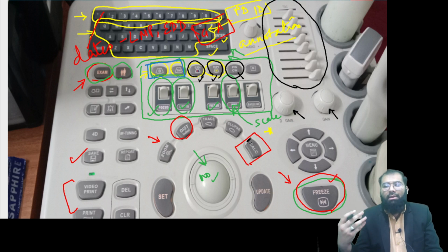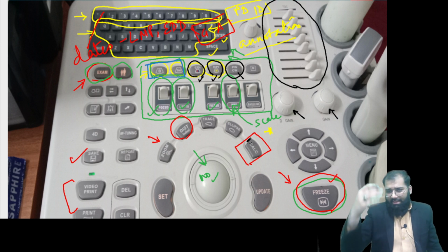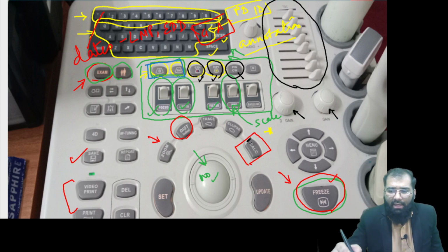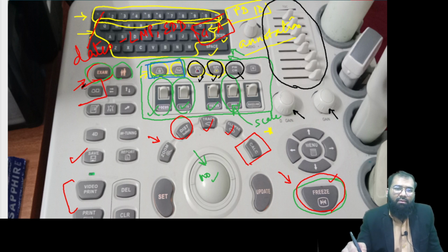One of the very important parameters, they are first trimester parameters and the second trimester parameters. Based on this, the calculation can be done. Then you've got ellipse and trace, which can be used to calculate the area, etc. A very common calculation which you do is calculation of volume in case of various collections, in various cases. So these are the common buttons which we use routinely. Another very important button is the dual button, which is very important. Okay, dual.